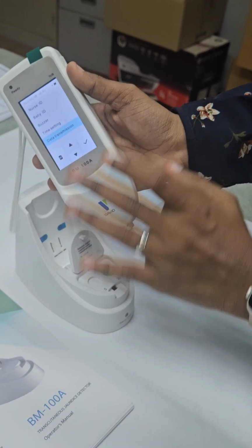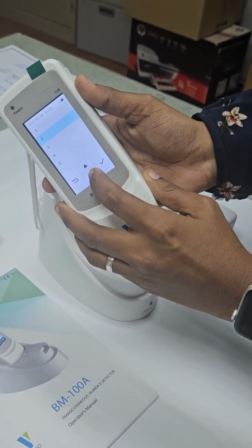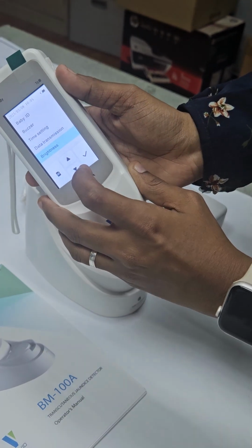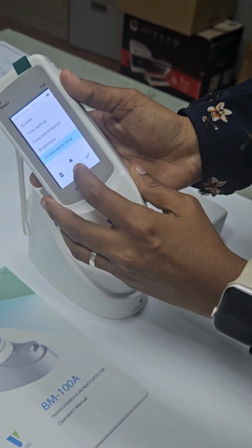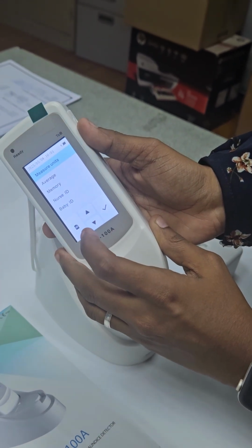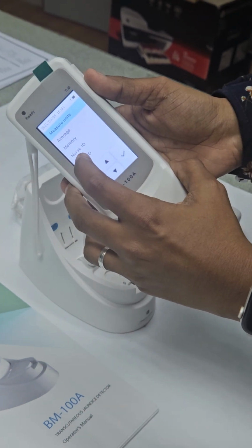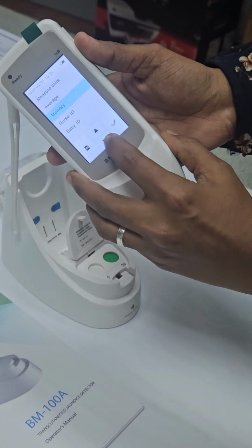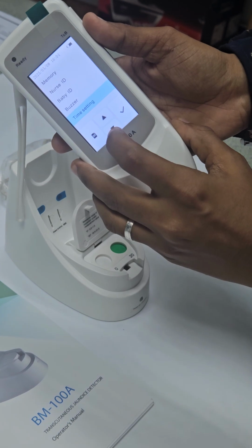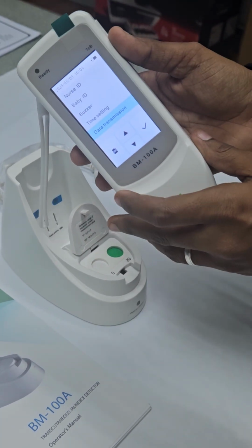Okay, data transmission, this unit doesn't have it, so there's no option for this. Brightness, there's an option up to 5. Okay, and screensaver time, software version, that's all. So in the setting, measure unit, average, memory, nurse ID, baby ID, buzzer, time setting, until time setting is the main, important ones.